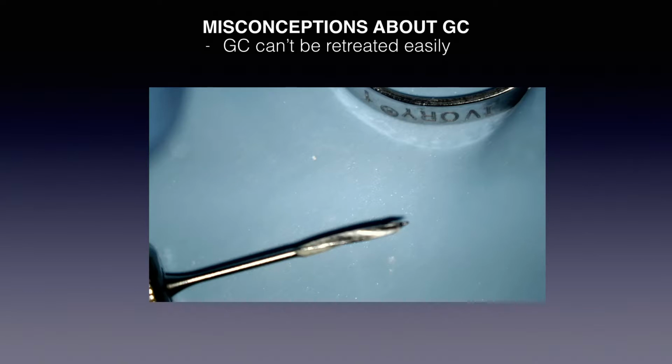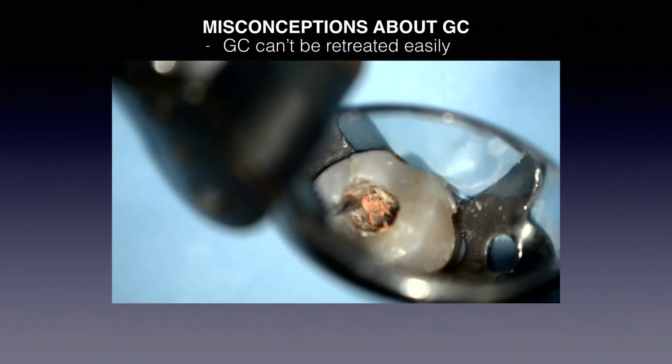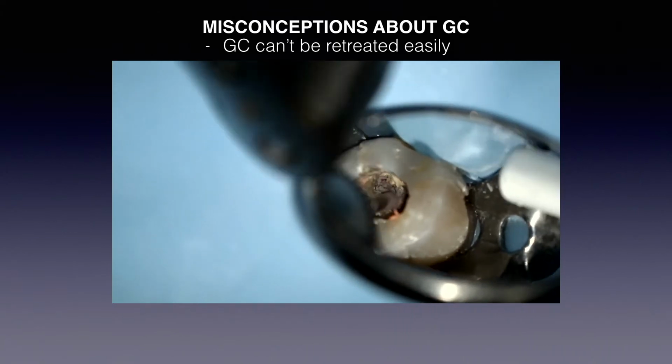You got time, you're good, there's no pressure there. So that's one thing. Another one is, oh, I can't retreat Guttapercha. Well, I can't retreat GuttaCore, excuse me. Well, it's Guttapercha. So ask yourself, how do you retreat Guttapercha cases? Well, just do it the same way, that's it.